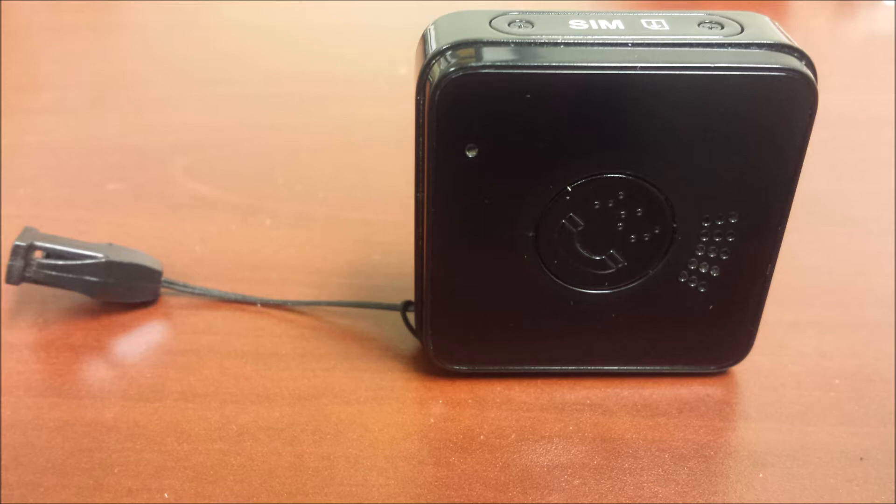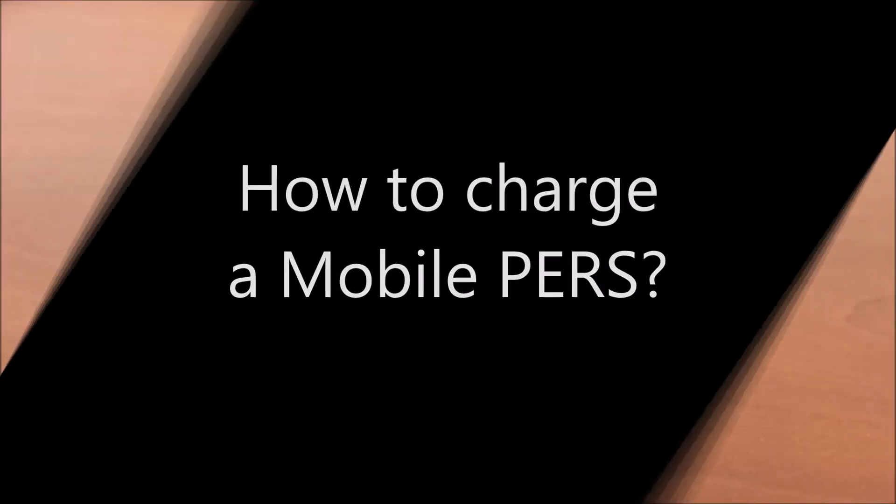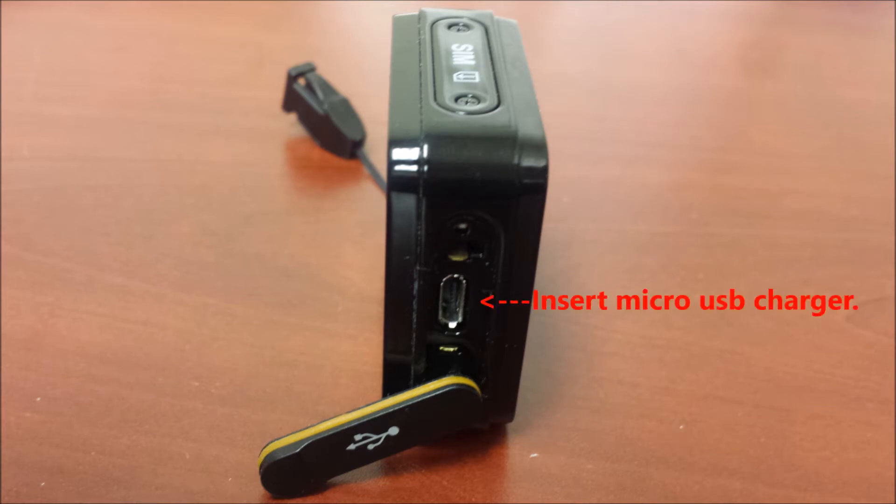The device needs to be charged once every two months to maintain optimum battery life. To charge the MobilePERS device, simply insert the micro-USB cable included with the device into the micro-USB slot of the MobilePERS. Then plug the power adapter into any standard electrical outlet. Please leave the unit plugged in for two hours to receive a full charge.